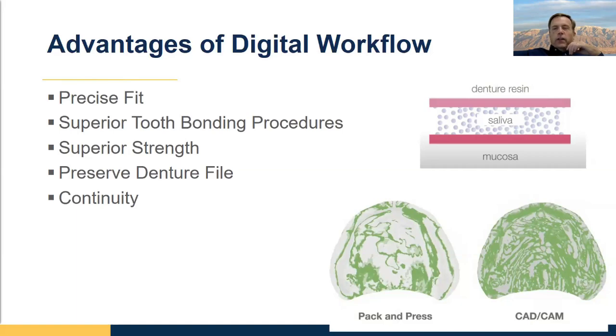I mentioned this earlier, but the newest generation, and this is a huge thing, and we'll talk about this more in a minute. The first generation of printed denture materials were not known for their strength or stain resistance. It was a bit of a difficult situation, and so sometimes people got a bad feeling about them, but the latest generation have really high strength.